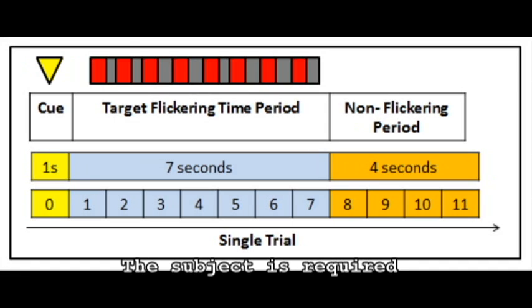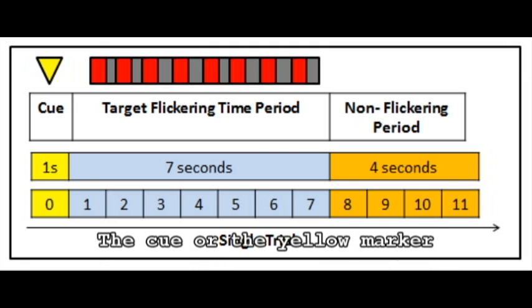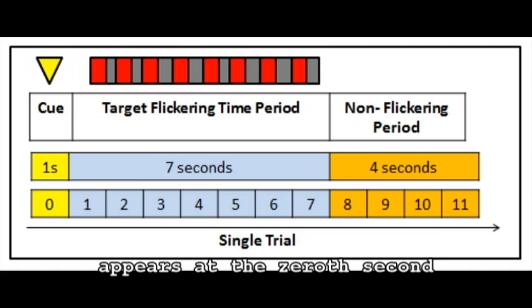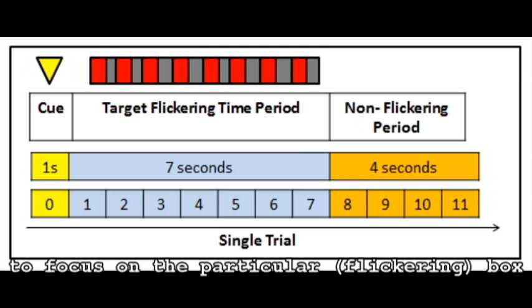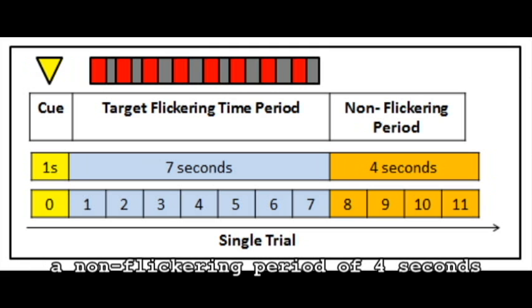The subject is required to undergo a training session that follows a protocol as shown here. The Q or the yellow marker appears at the 0th second. Following this is a flickering time period of 7 seconds during which the subject has to focus on the particular box. This is followed by a non-flickering period of 4 seconds.